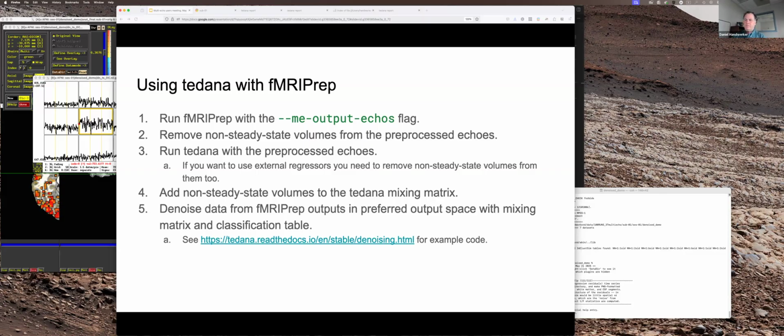I would also, in terms of the difference in software, there are cases where the same thing is called different words in each case. So censoring and scrubbing might be a famous case. When we talk about running principal components of regions, yeah, we erode them and that too. So I think there are times where the difference is really the phraseology. It's not always the case, and there are other things too, but that is certainly a challenge in using different software. But again, that's only kind of a question away that can be asked too.